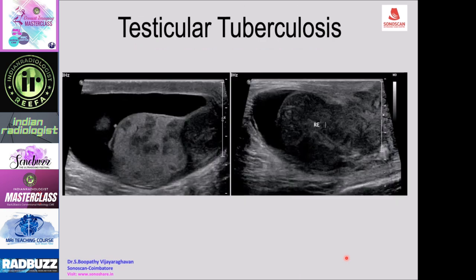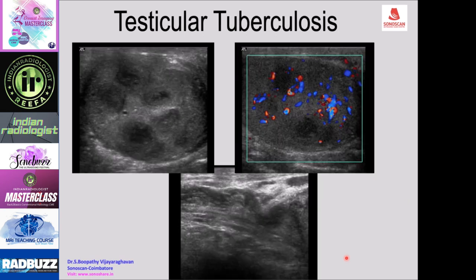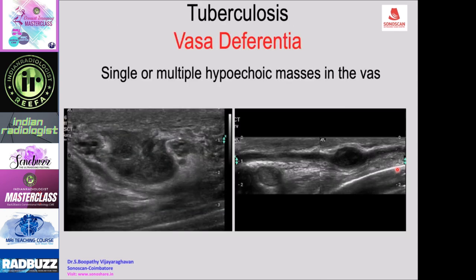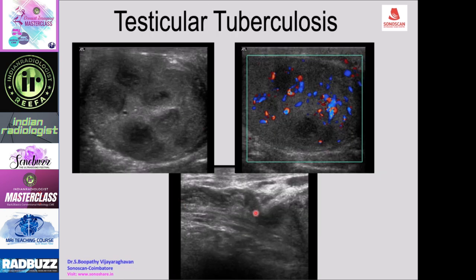In another case of tuberculosis, larger echopoor masses are seen in the testis with hydrocele, a mass in the tail of the epididymis, and on the right side the entire epididymis is enlarged and echopoor. In another case, testicular tuberculosis appears as multiple abscesses with no flow on power Doppler but hyperemia of the rest of the testis. The clue for tuberculosis is the thick vas deferens.